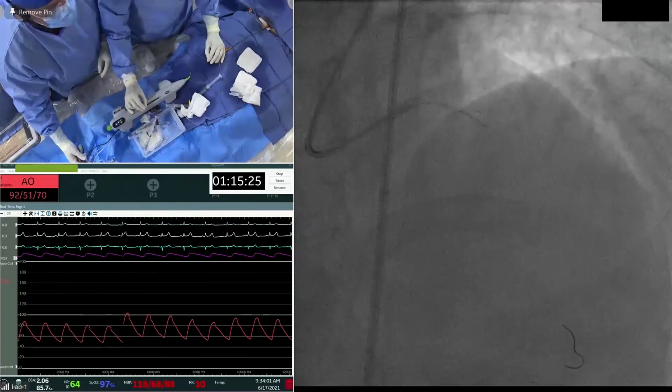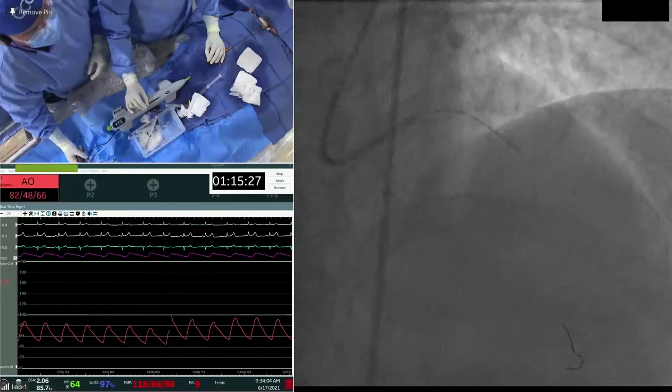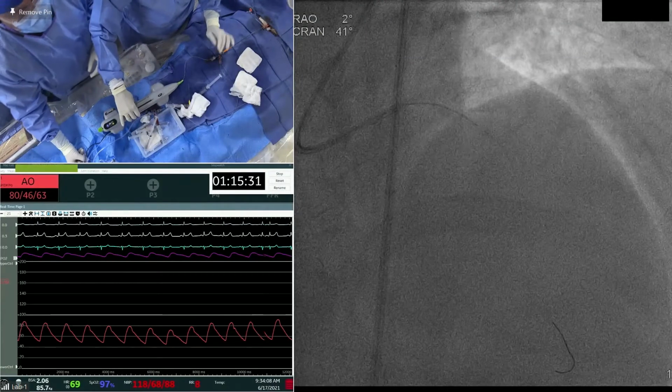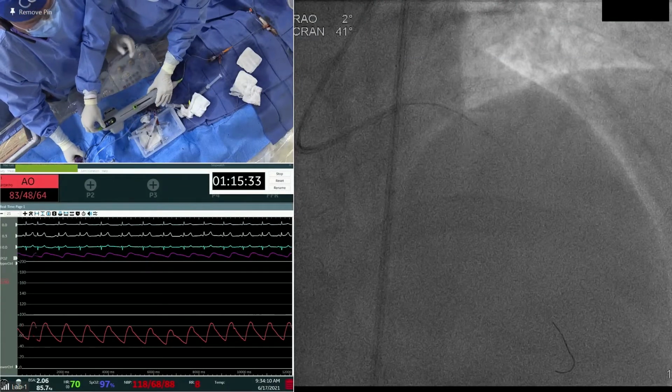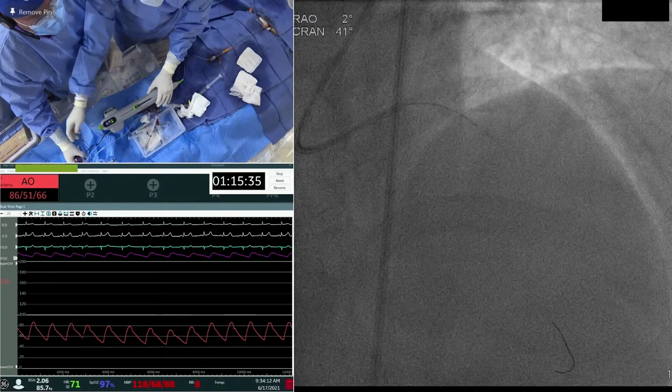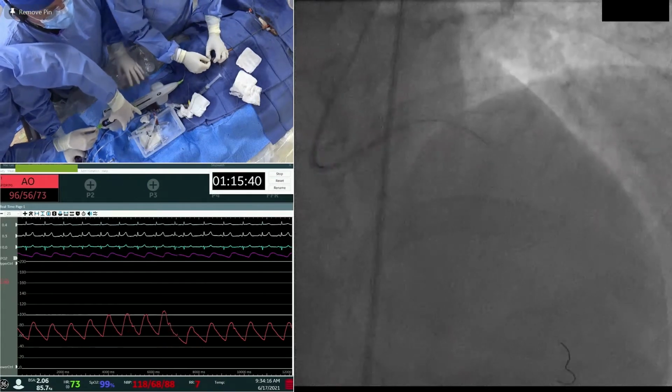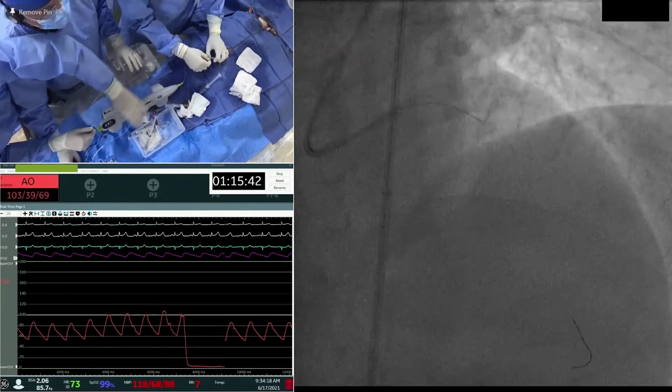Yeah, slow. All right. So we're starting with the orbital at 80. We have very good reflow on the left main, so we wash out all the embolization. Okay, start coming out. We did it at 80 speed. We did two glide runs, assist.